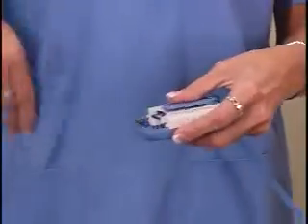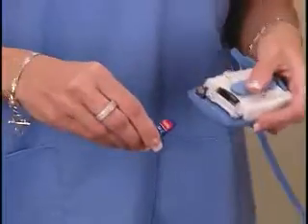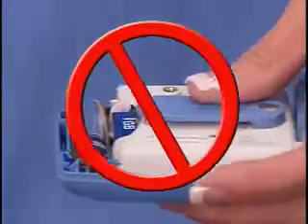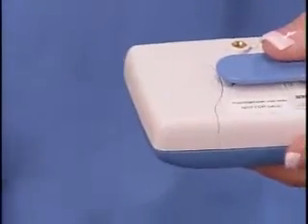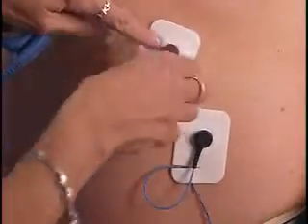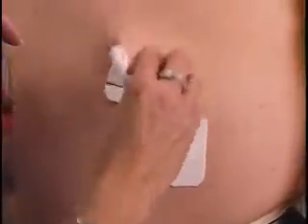Remove the battery from the device and then remove the SD card from the recorder. Never remove and then reinsert the battery into the recorder while the SD card is still inside, as it will erase all the patient data. Next, remove the patient cable from the electrodes and carefully remove the electrodes from your patient.